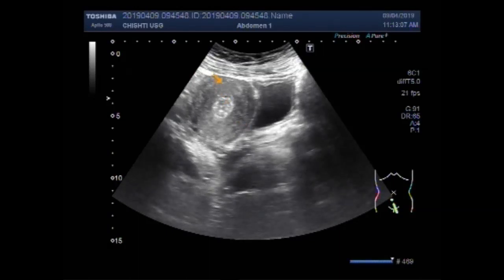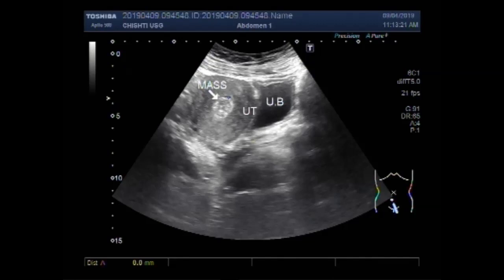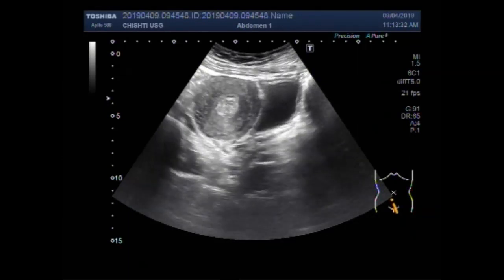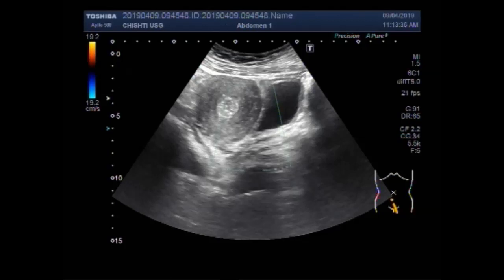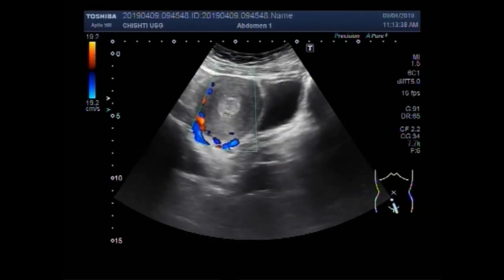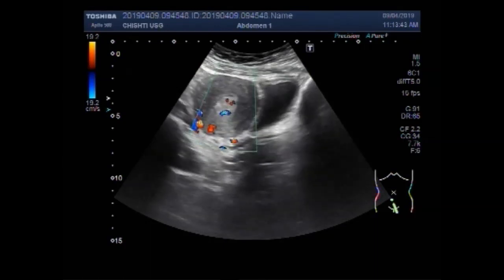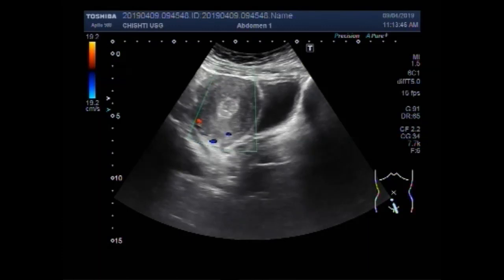This is an echogenic mass. This is the uterus, this one is the urinary bladder, and this is the uterine mass seen in the distal portion of the uterine cavity. Measuring the mass, it measures about 18.4 x 17.9 millimeters. The mass has quite significant blood flow in its interior.